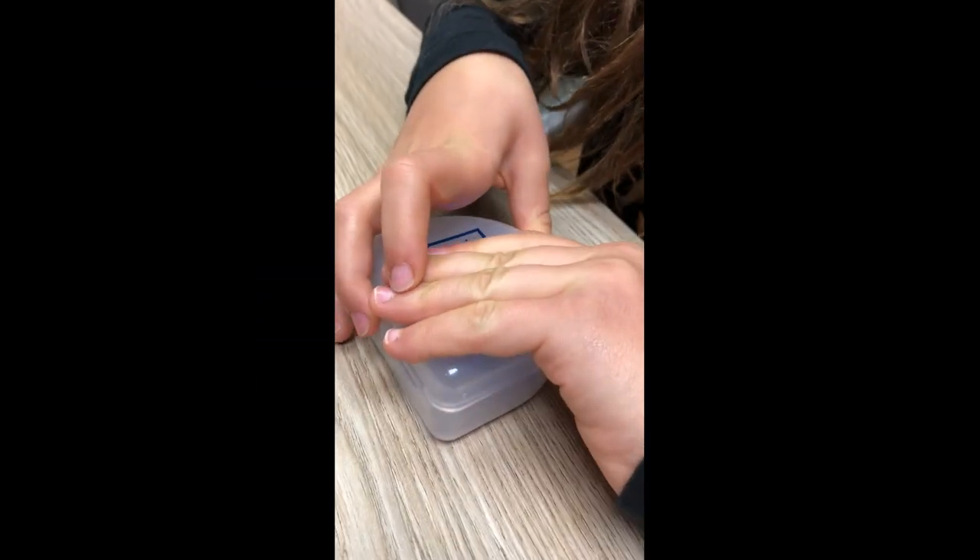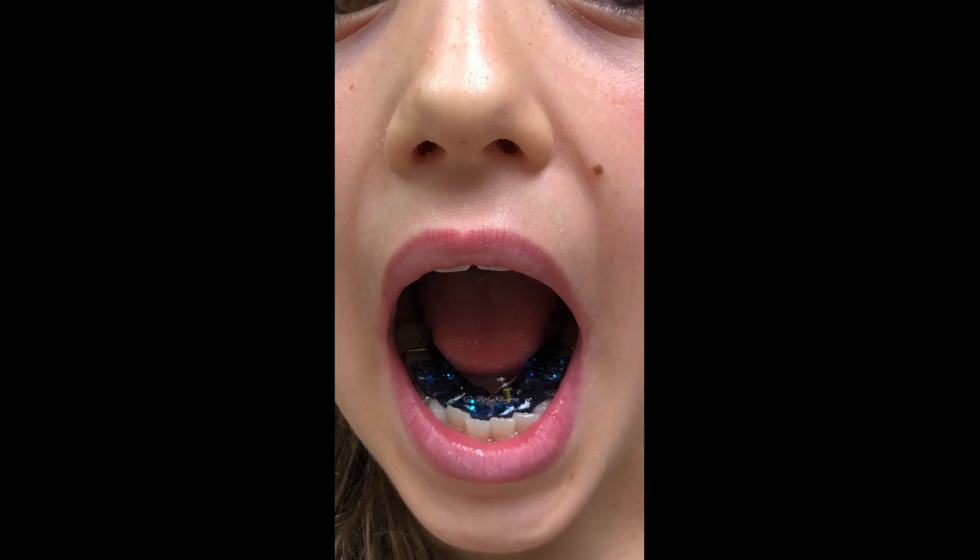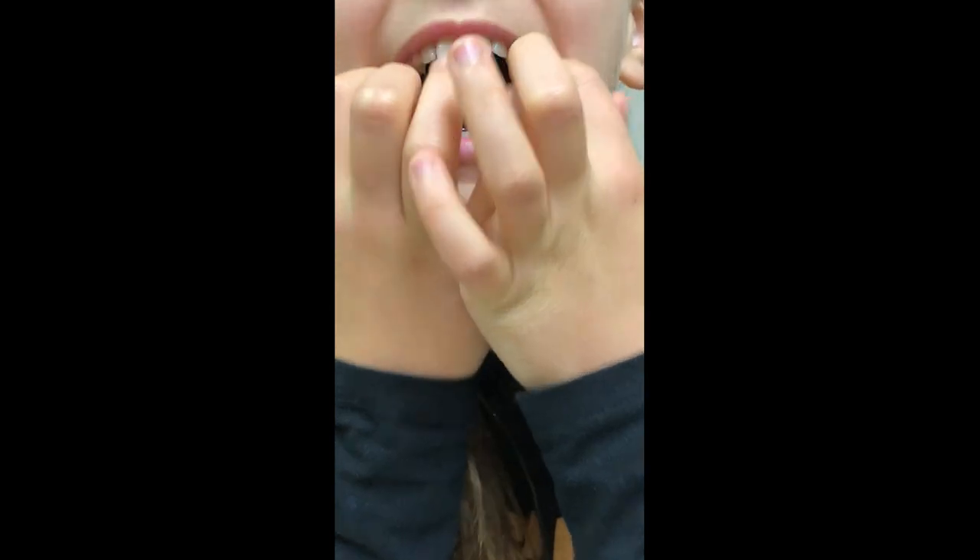Perfect, good job — just kind of open it up. So that's how you bite. When you bite down your jaw is gonna come forward. I'll take it off again — let's see what it looks like. Show me the upper one. Wow, nice glitter!